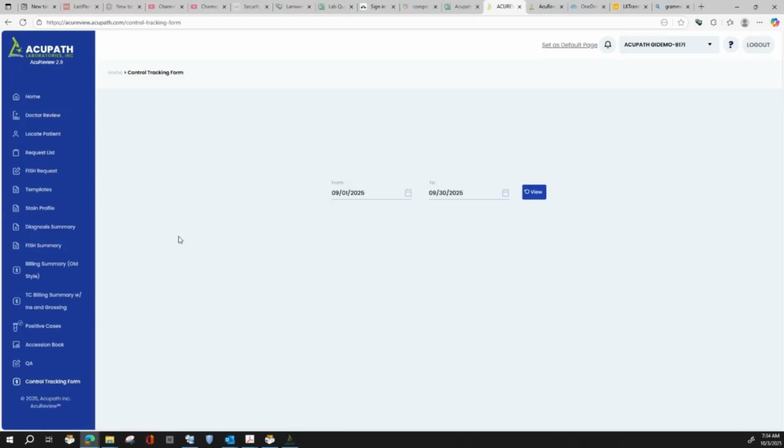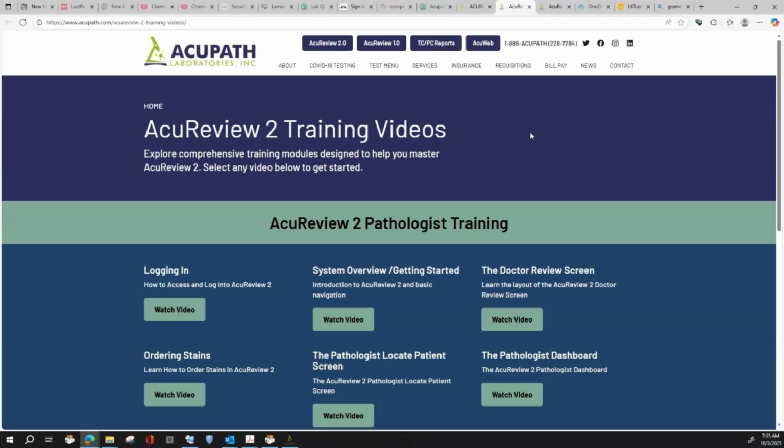And so that's all the reports in AcuReview 2. And we have other trainings available for other topics. If you want to look at what we have, you'll see on many of these screens, there's a question mark. If you click the question mark, it will take you to our webpage where we have the list of all the training videos, and you could hit watch video and you could see one of the videos from there.